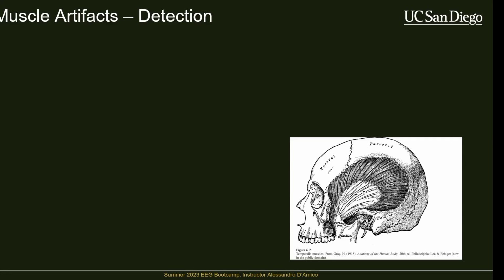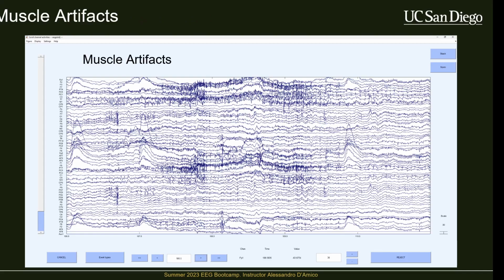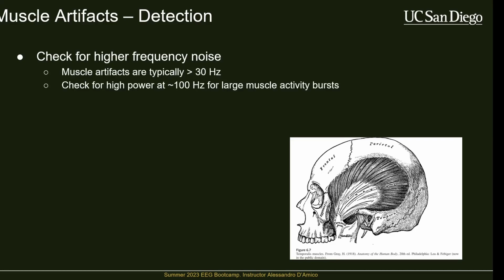So detecting muscle artifacts is pretty simple. I mean, obviously you can see them just with your eye, and again, these aren't even that bad. And in general, we can just check for higher frequency noise. Most artifacts are typically much faster than 30 hertz. And we can also look for high power, especially in the 100 hertz range. It's usually going to be muscle activity, because again, the EEG activity in those much faster frequency ranges is quite attenuated. We don't really see a lot of it.